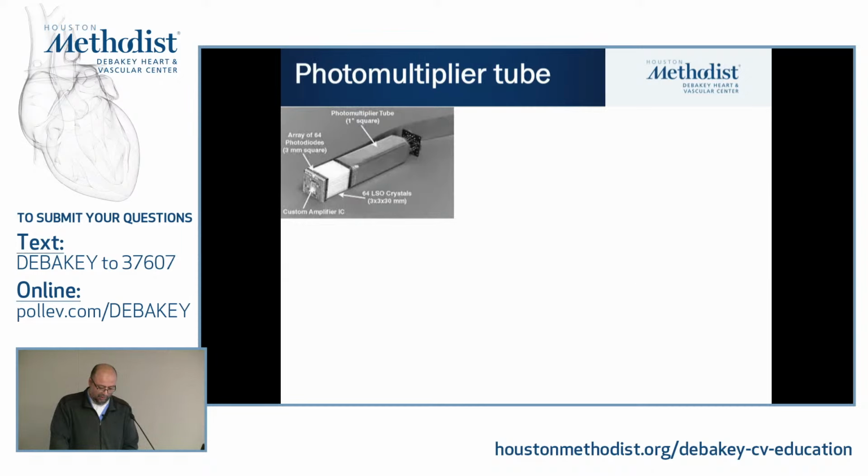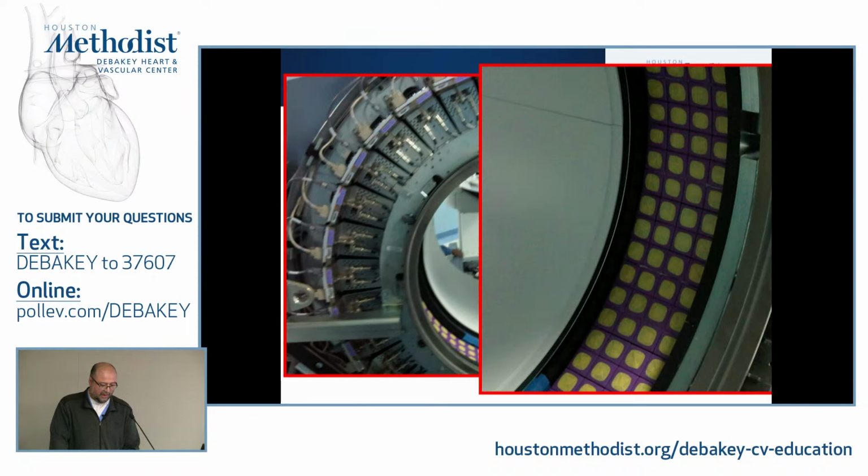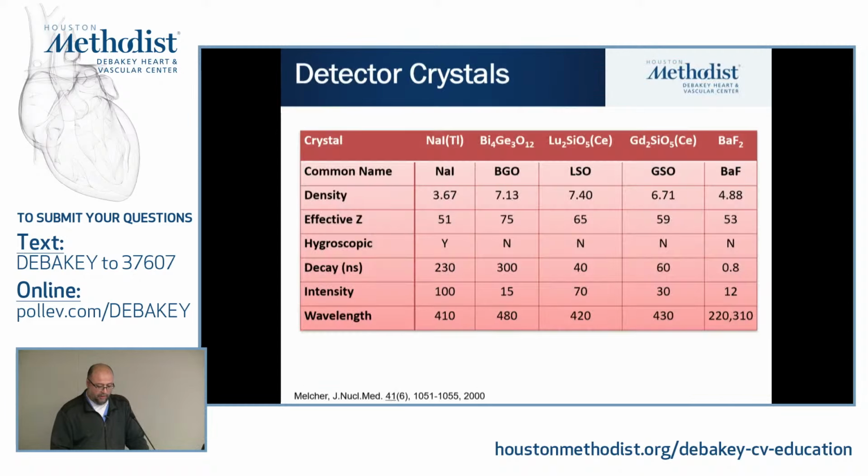So what I showed you here is that you have rings. Under every ring here, you see there is a box of crystals, and then under it there will be multiple crystals sitting in there. If one is defective, then service will come, take it out and put another one. So you cannot have a defective one when you are capturing images.